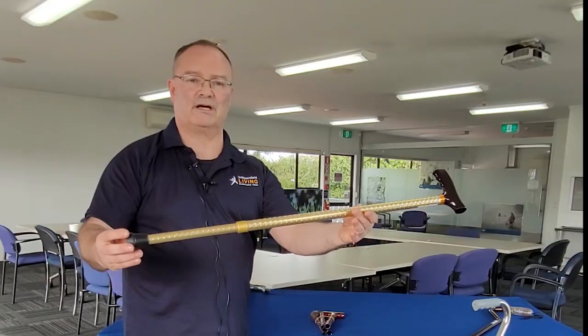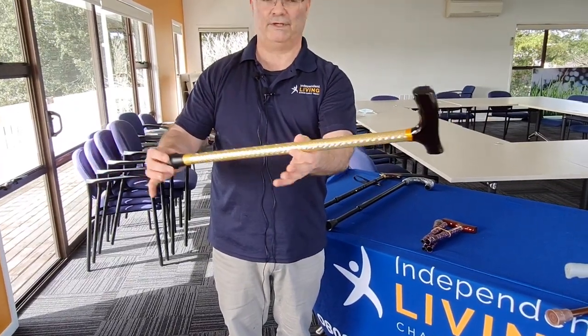Just to show you, our telescopic sticks come in all sorts of different colors — this is our golden stick — and again as you can see, fully adjustable.